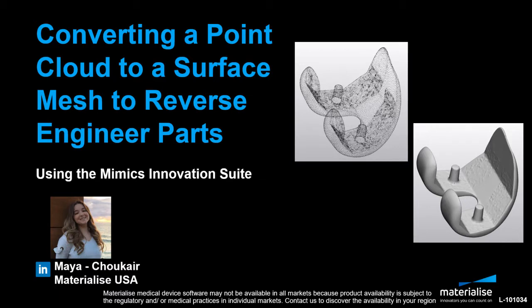People will typically scan that physical device using an optical scanner and get a point cloud file as a result. In 3matic, we can take that point cloud, reduce the scatter or noise in the point cloud, and create a surface mesh that you can then manipulate, analyze, or export as a CAD file.